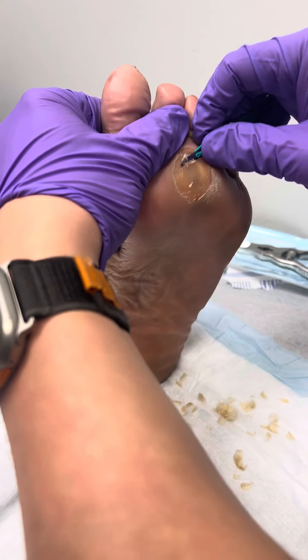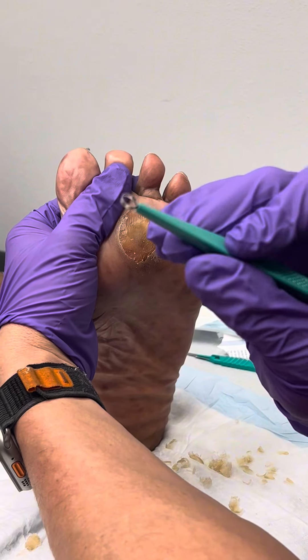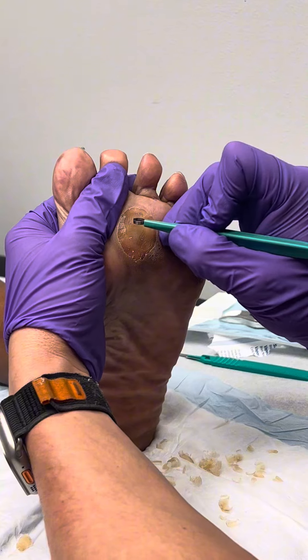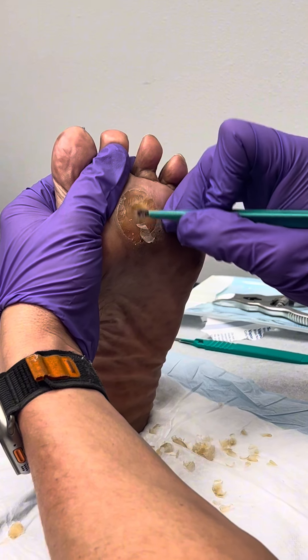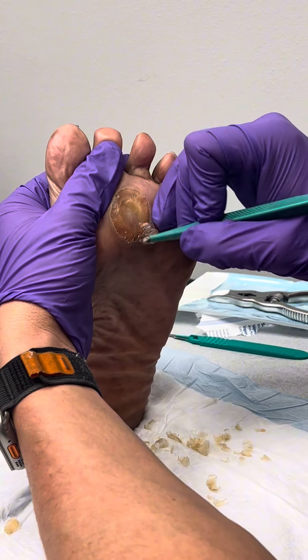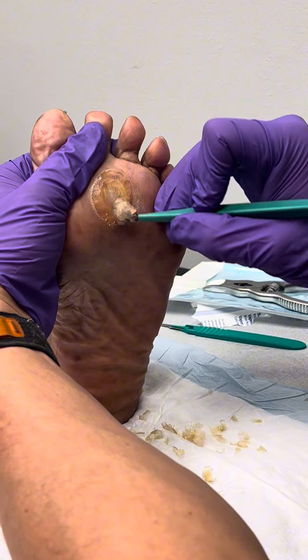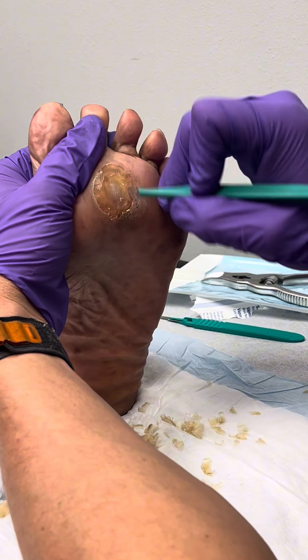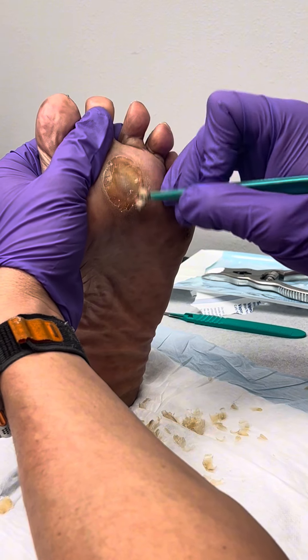Now we're coming in with what's called a dermal curette. This is a round blade and it allows us to scoop rather than cut, and it's a great tool to get that core of the callus. You can see all this dead skin that is able to just be scooped away. This is a really sharp tool, so you don't want to put too much pressure — you just let the tool do the job.